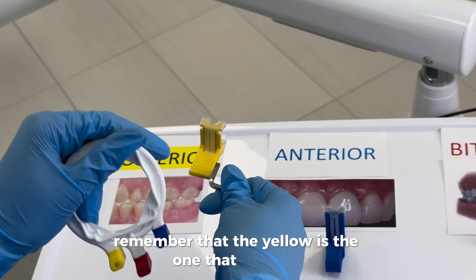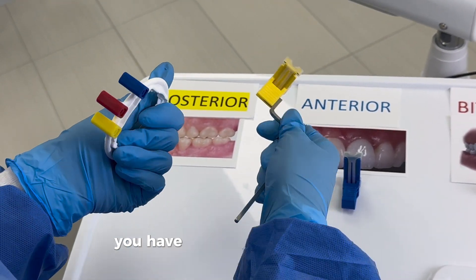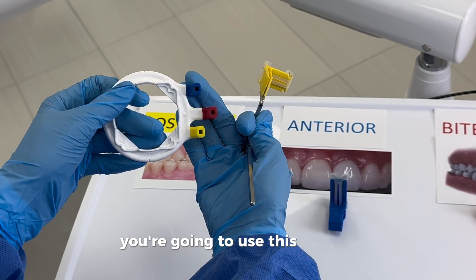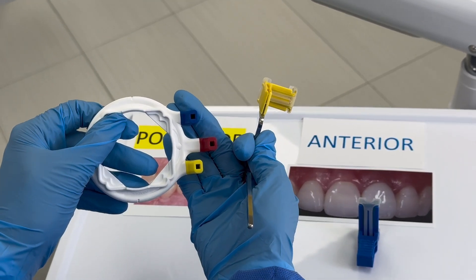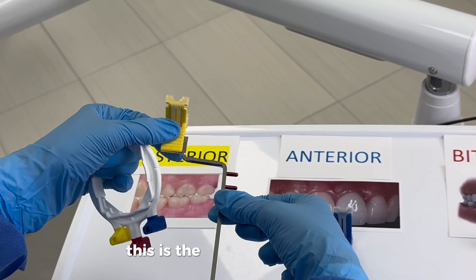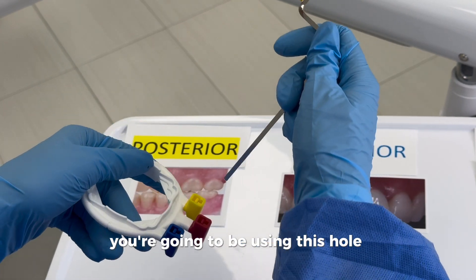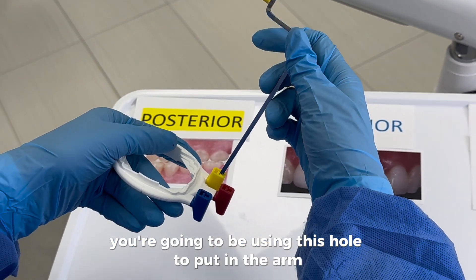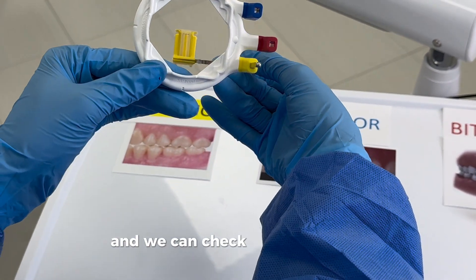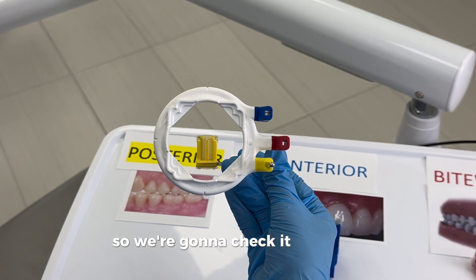For the yellow, just like the singular arm, you have to flip it. With all of the other bite blocks you use this side of the hole, but when you do the upper right — arm on the right, facing up — you're going to use this hole to put in the arm. Check it and it's right in the center.